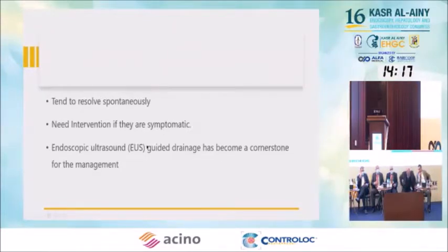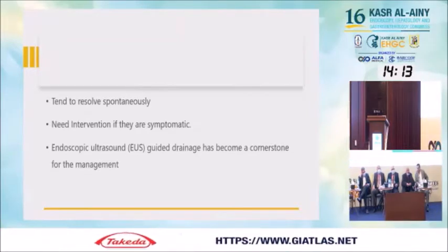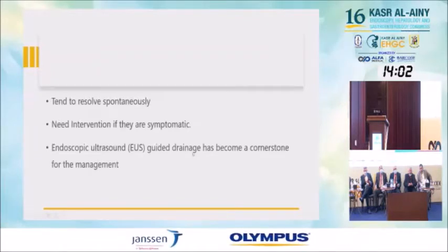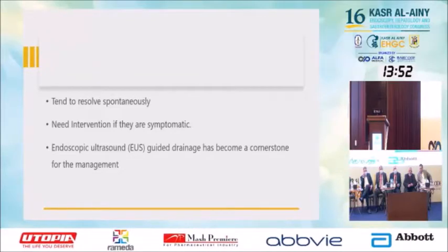We know that there are many modalities for pancreatic pseudocyst management, like percutaneous, surgery, and EUS. Endoscopic ultrasound guided drainage has become the cornerstone for the management, over percutaneous and even over surgery, except in certain situations.